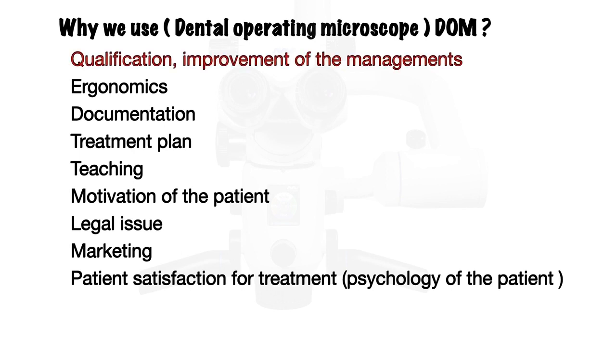So, qualification of your work or improvement of your management. I want to remind you that before I used a microscope, I used a dental professional camera. At that time I did composites, but when I believed that we should use magnification in dentistry, I took pictures of my composite restorations. Really, I was shocked because I found gaps, something not believable.